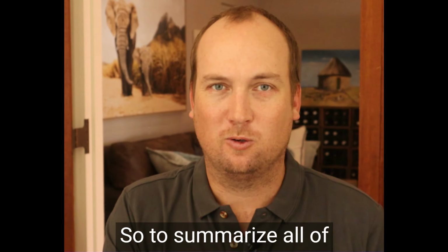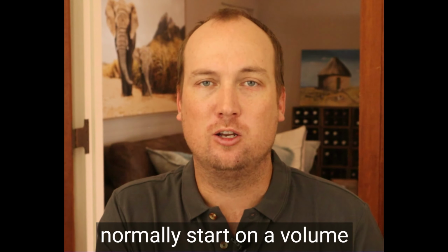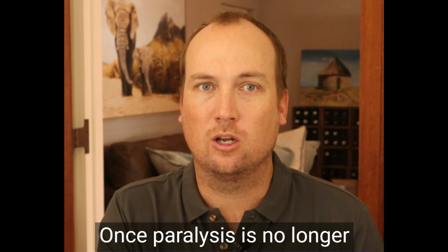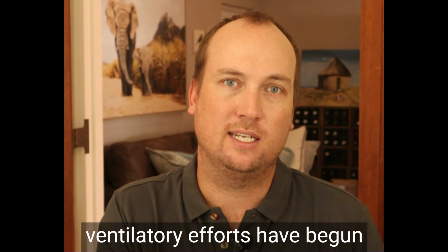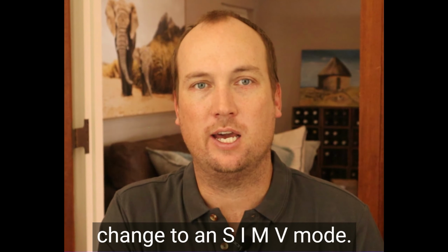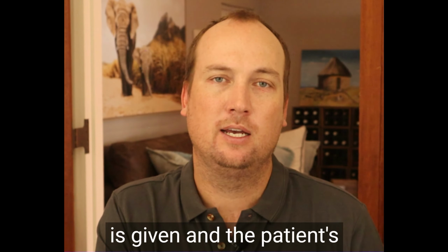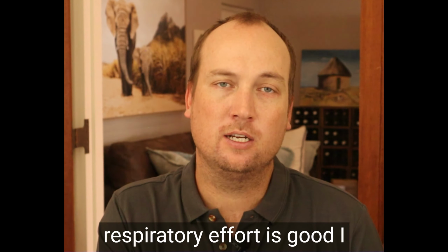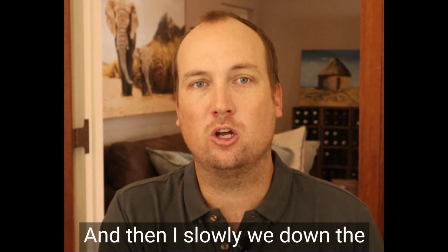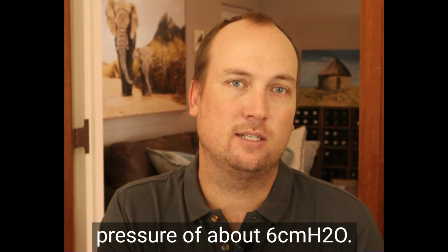So to summarize all of that, in intubated patients, I normally start on a volume-controlled ventilatory mode. Once paralysis is no longer needed and spontaneous ventilatory efforts have begun, and I can see that on the ventilatory graphics, I then change to an SIMV mode. And then once reversal is given and the patient's respiratory effort is good, I then change to a pressure support ventilatory mode. And then I slowly wean down the pressure support to a driving pressure of about 6 centimeters of water.